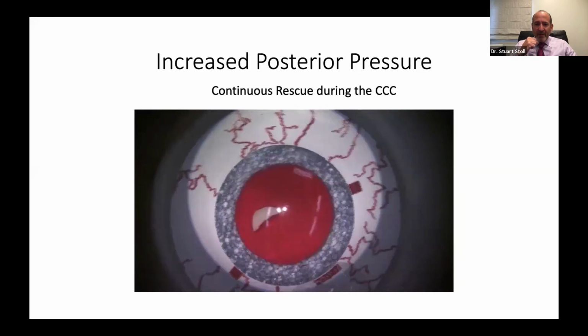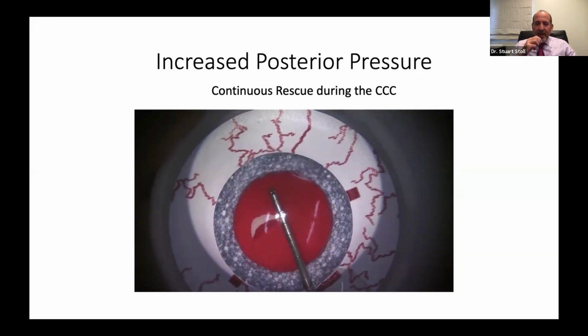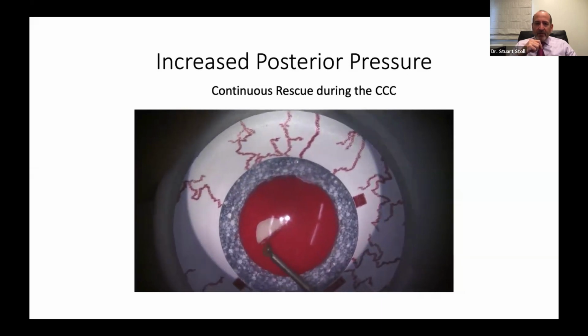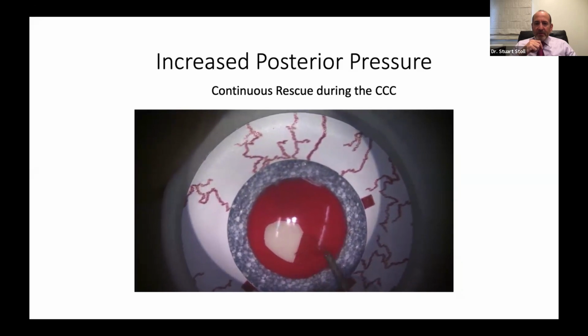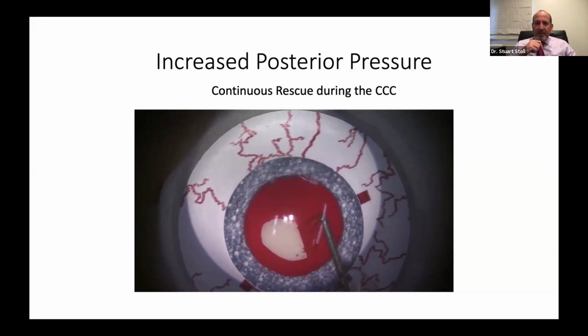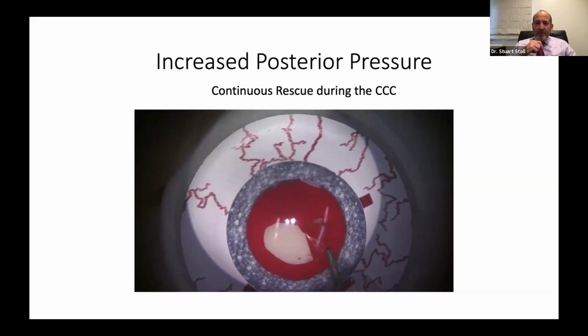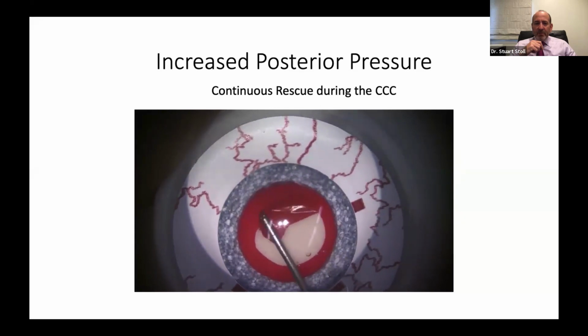What I mean by that is you're going to be pulling more radially at certain times as you're propagating the tear. So here we go. Everything's under control. We've initiated the capsule. We flipped it over. We've got great control. We're going to regrasp here. Tension off versus tension on. There's off. There's on. Tips are out. Everything's just going perfectly. What could possibly happen?